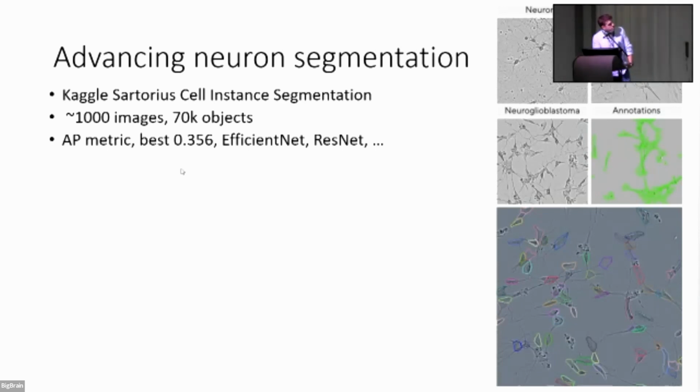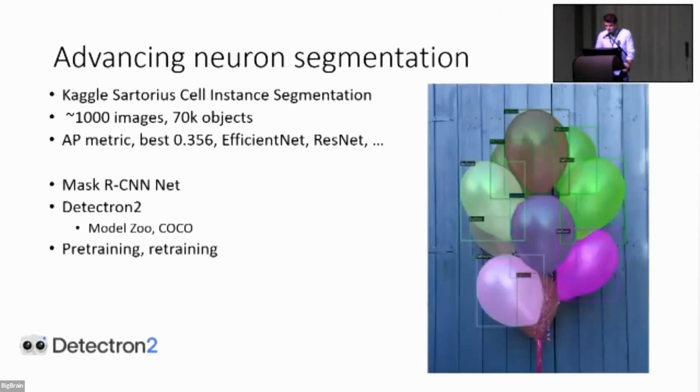So we thought, maybe we can just take their results and see how it works. But it turns out it didn't work that well, because the images they were training on were different from the ones we have. So the next thing we are trying to do, I hoped it would be finished for Zadar but it was not eventually, is to use the same approach.